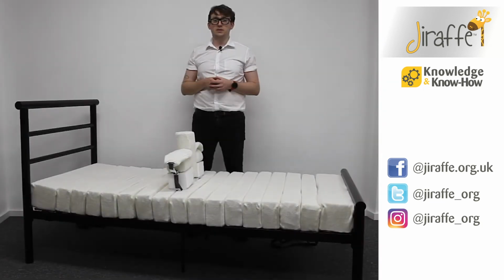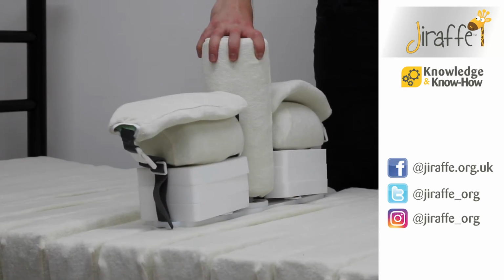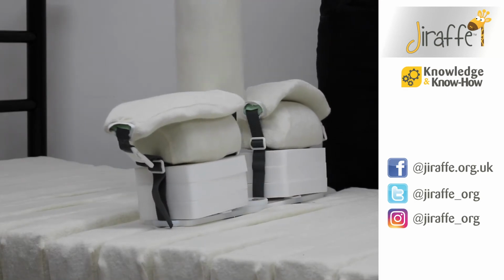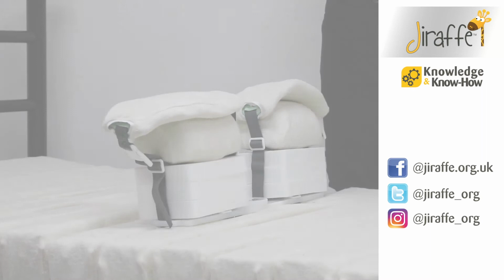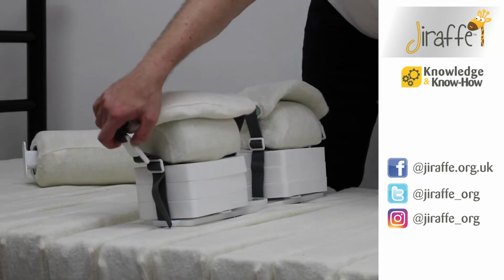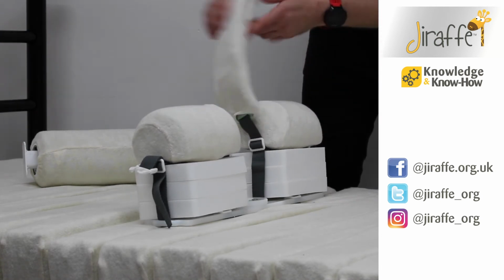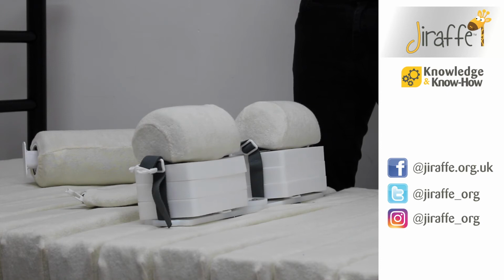Now that the T-roll is in place, there's a few adjustments we can do. First of all, we can remove the abduction block. We simply rotate it and lift it out of position. We have two knee straps with clips either side here, so we're able to assist with strapping the knees in if required.